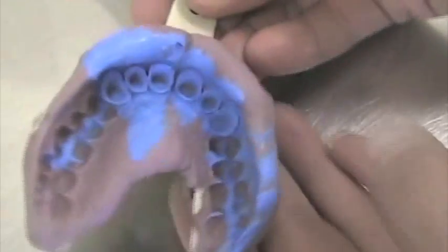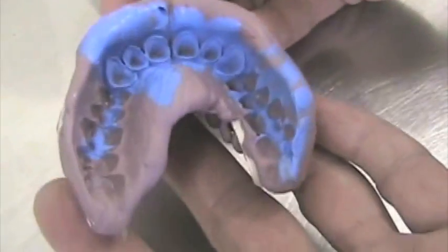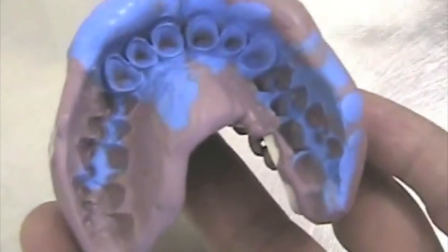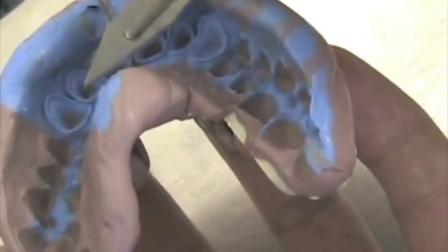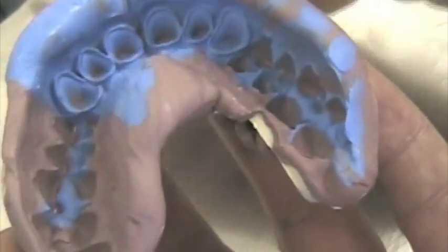This is the impression we are going to pour. We are going to focus on the interior. As we see, we have six preparations there with very nice margins, very defined, very precise and very sharp.